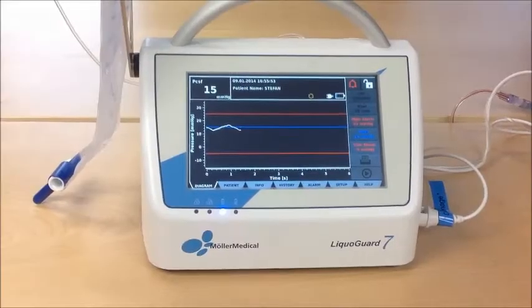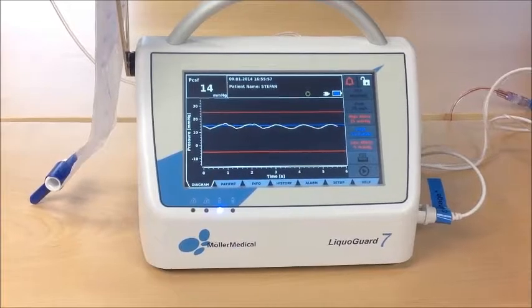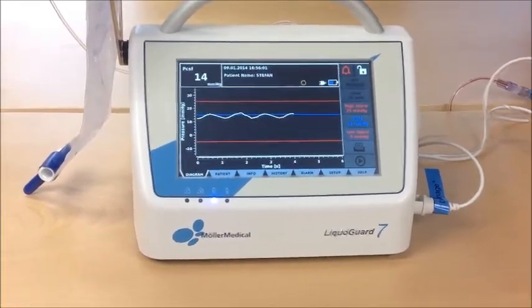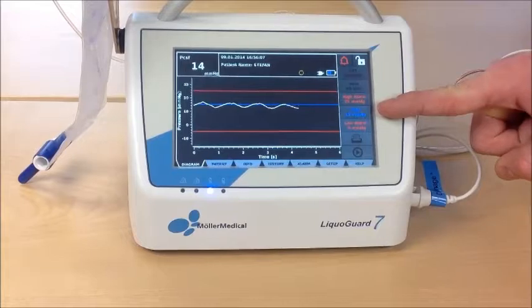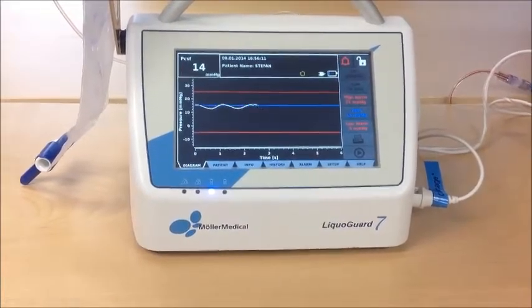During CSF drainage, you can do pressure control drainage or volume control drainage with the LifoGuard 7. When you want to do pressure control drainage, you choose a reasonable high P set, which is the pressure you want the patient to keep.